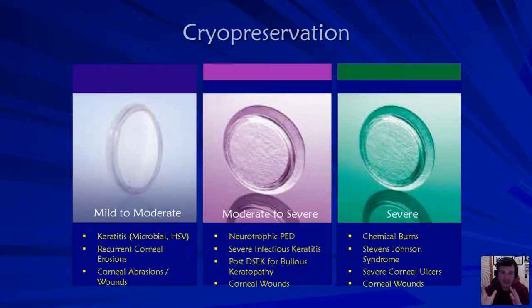Now, if you have an infectious corneal ulcer, they might burn through it in 2 or 3 days because the eyes are really, really hot. So the next question I usually get is, what's the perfect time that it could be on there?